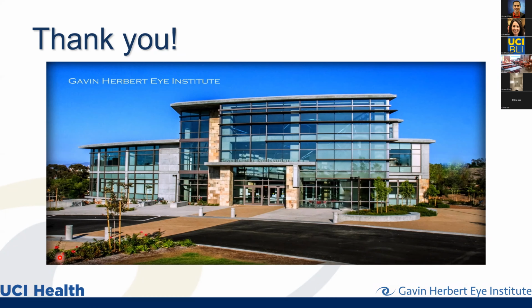Maybe I could give the example that we often do multiple spots for different conditions, infections for example, because for an infection we can clinically say this is the area that's infected. Then we can image the infected area and multiple spots around the infection. For this, the whole eye in general is being exposed to the same tear film, with some exceptions, right? Because if the patient has an eyelid closure issue, then there are some areas that aren't affected and some areas that are affected. So this is a good question.